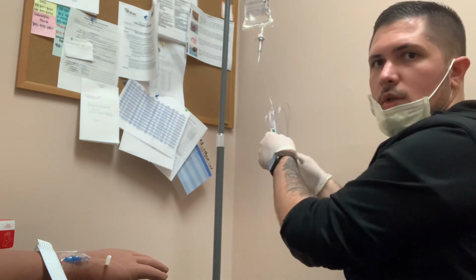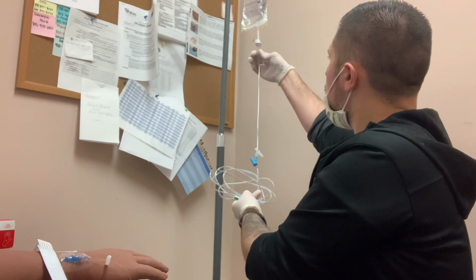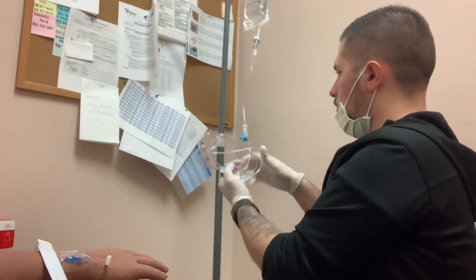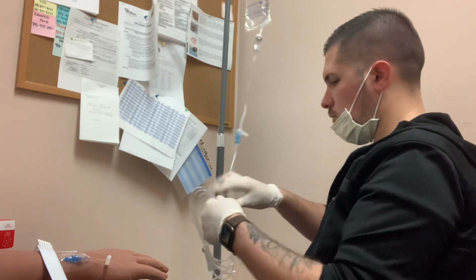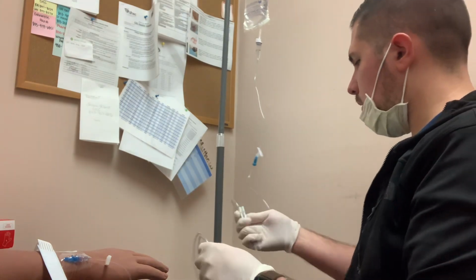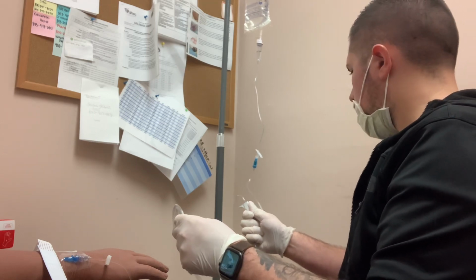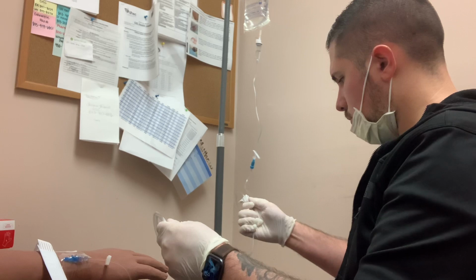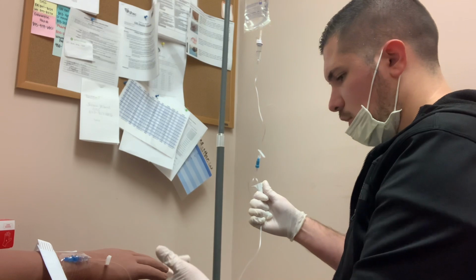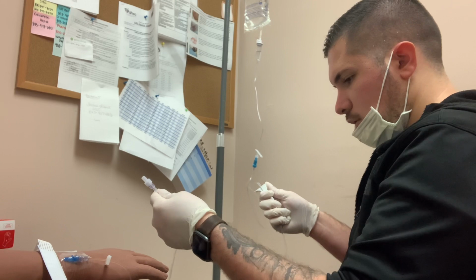Alright, so now that it is hung, we are going to press and fill the chamber up halfway with the fluid. And then we are going to prime it by slowly releasing, making sure we get no air bubbles, and making sure that none of the fluid escapes the tubing.